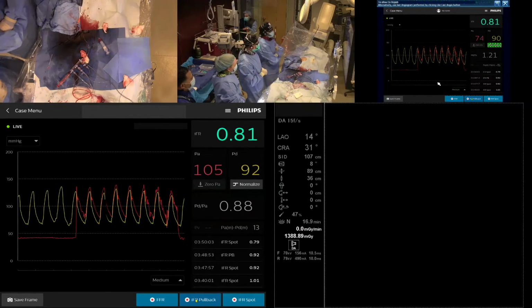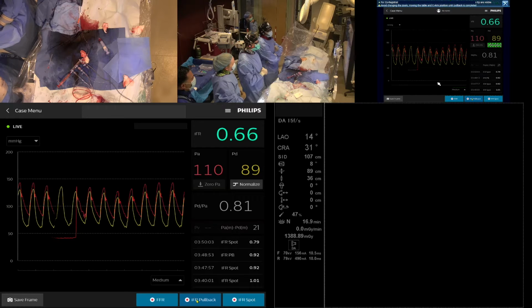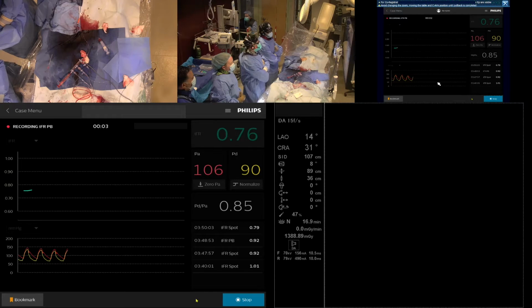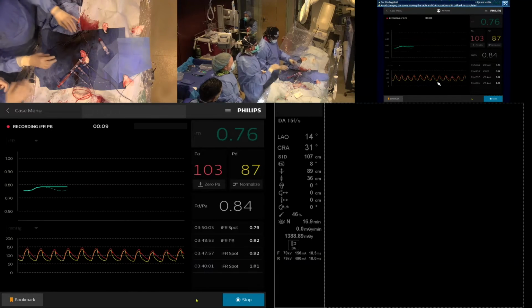Right, but the second lesion is probably there. Is that spasm though? I mean. No, it's actually there on the original angiogram for certain. Really? Yeah. Well, let's do a pullback, right? The problem is this: you won't be able to deliver a stent there without opening the ostium. You have to at least balloon the ostium to get a stent across.